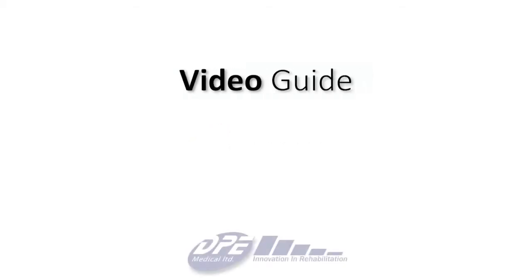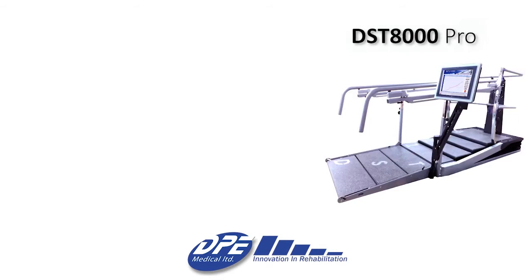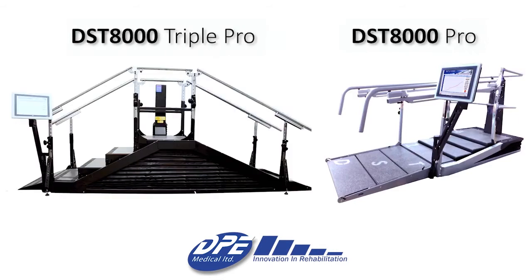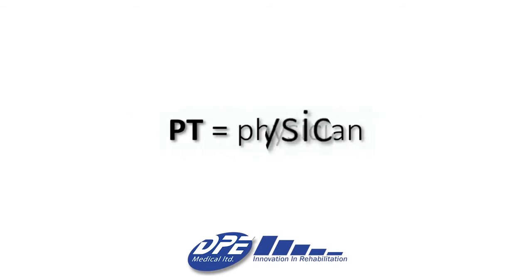In this video, we will go over the DST Pro system and its features. We will cover both the DST Pro and the DST Triple Pro, since they only have mild differences in regards to the software. Throughout this video, whenever I say PT, I mean physiotherapist or any other physician in your clinic.